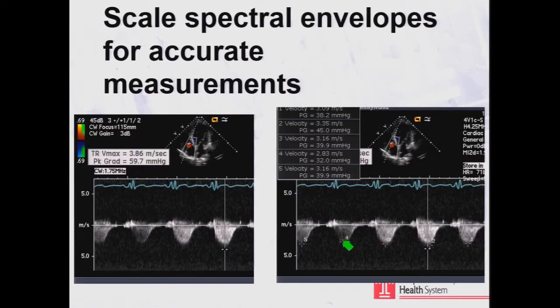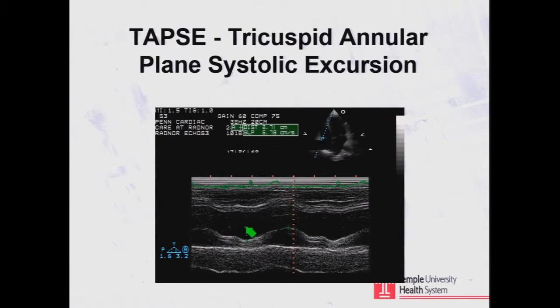The problem here is that any little change in where I'm measuring it propagates a very significant error because I'm squaring the measurement to get the gradient. And so this is just bad scale is the answer to what's wrong with this picture.